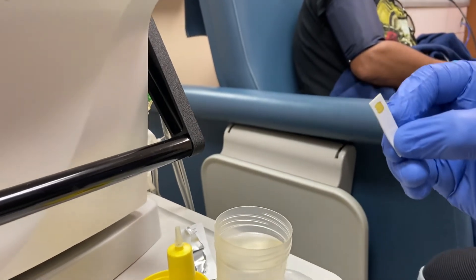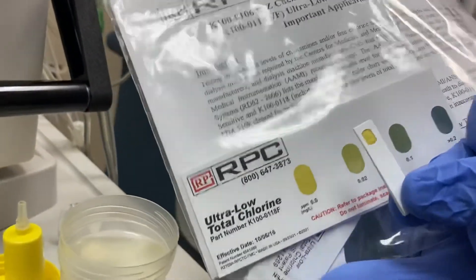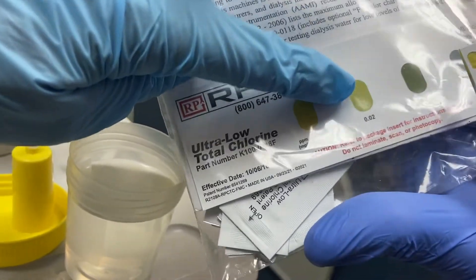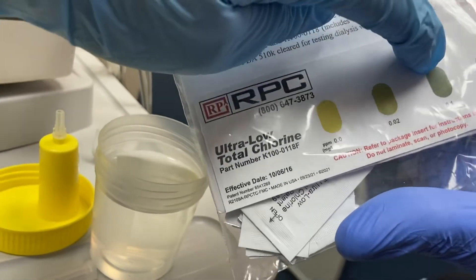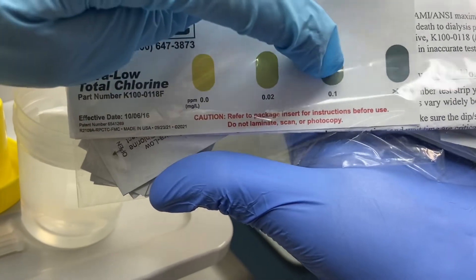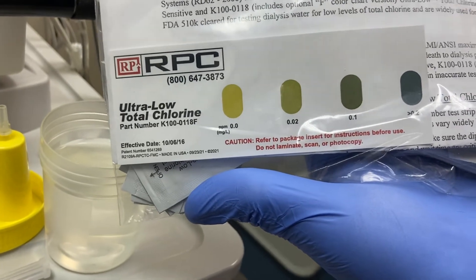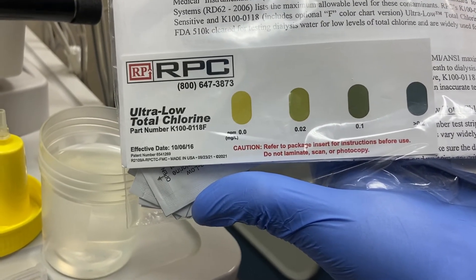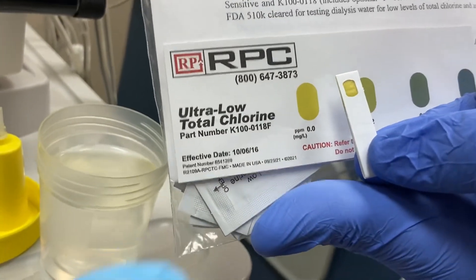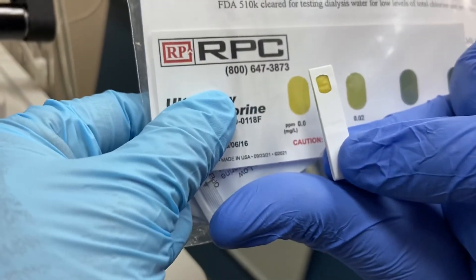And now you compare. You should get a score from here to here — not to that side. Because if you get from this to there, that's positive. And we're not using the batch if that's positive. So that's for sure we got negative, negative.